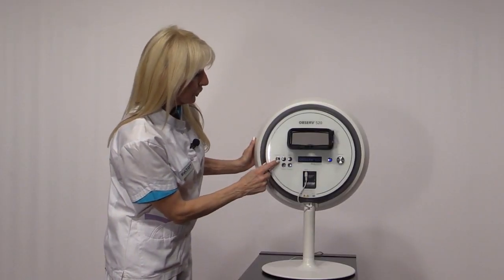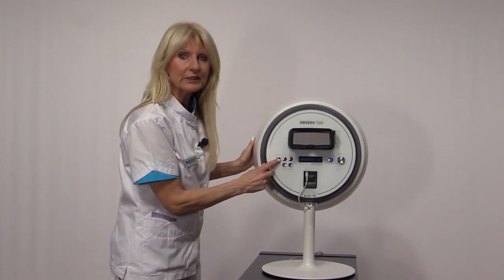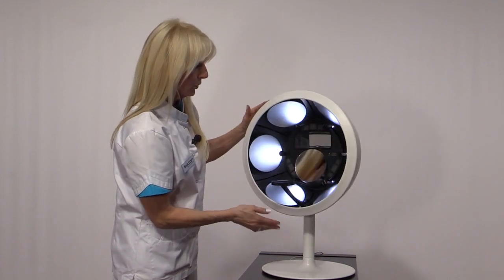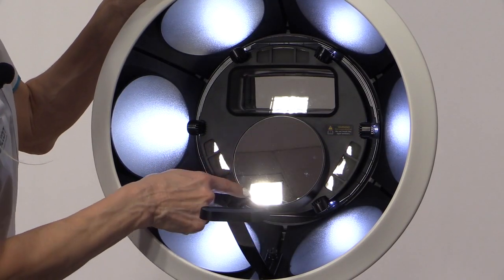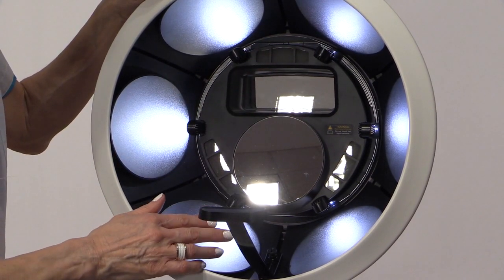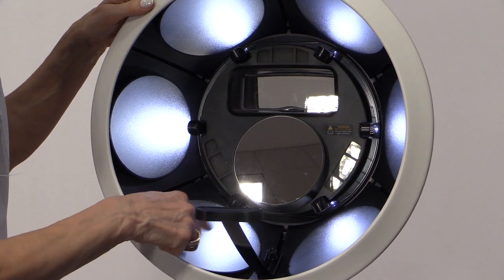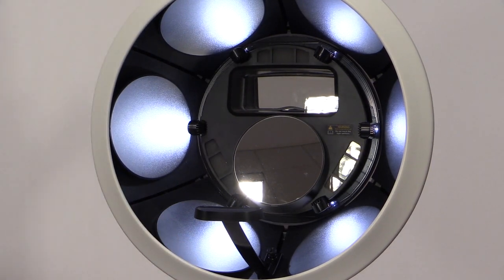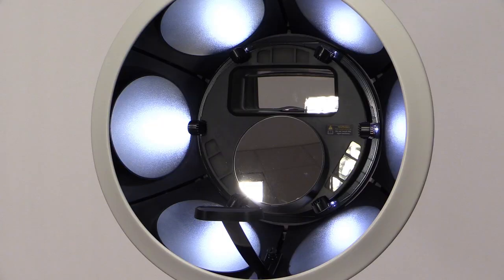So the first light I'm going to show you is the daylight mode, as we see our skin in the daylight. I press the button, it highlights in the middle, and I'm just going to show you what it's like. The device is equipped with 6 light emitters, which generate a natural daylight. The light is projected onto the skin in a very homogeneous way by these 6 diffusing reflectors. In this way, the skin is illuminated by a shadow-free shower of light, and it allows you to observe the skin in a natural daylight setting, which is the same for each time you do a skin analysis. The daylight mode is always the starting mode of all skin analysis.